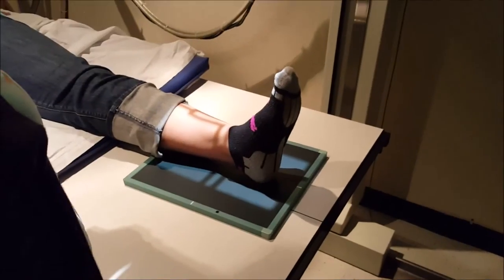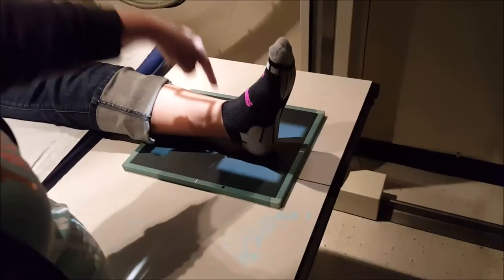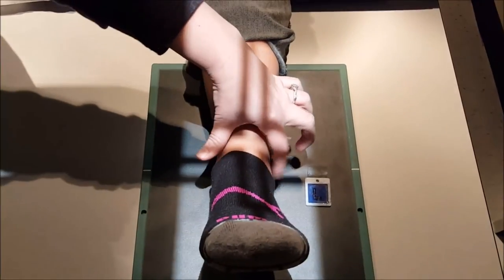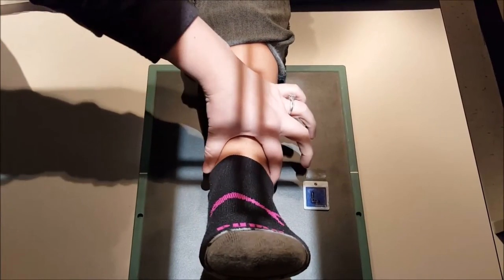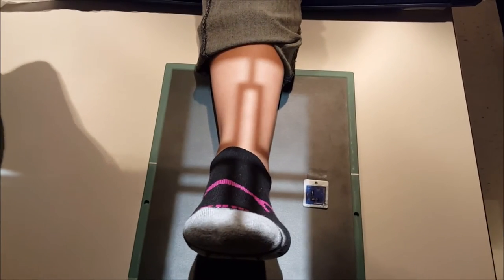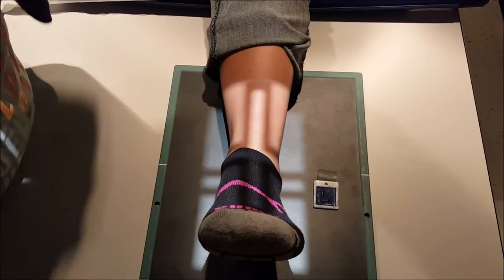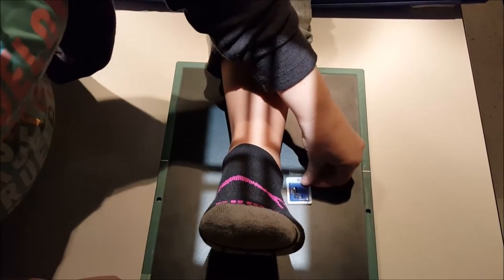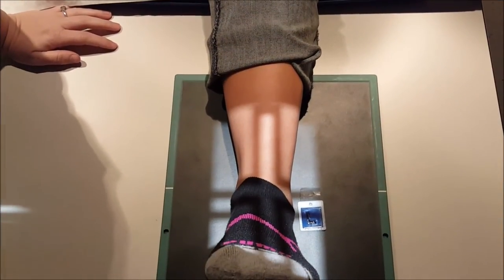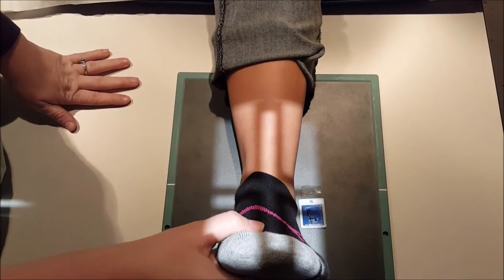For the ankle, we're going to have a 40-inch SID. We're going to use a 10 by 12 cassette, and we're going to be perpendicular to midway between the malleoli — so between your lateral malleolus and your medial malleolus. Marker on the lateral side of the anatomy. You want to have the patient dorsiflex their toes, but you don't want them to over-dorsiflex so that their toes are in the ankle.